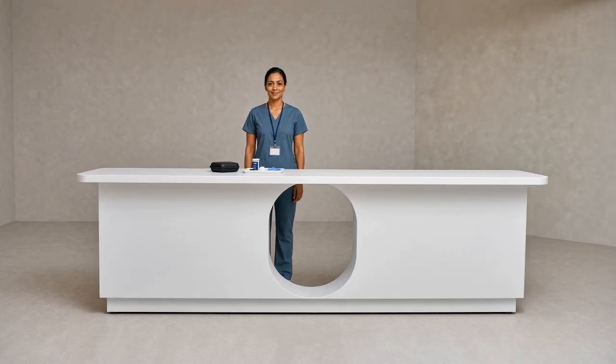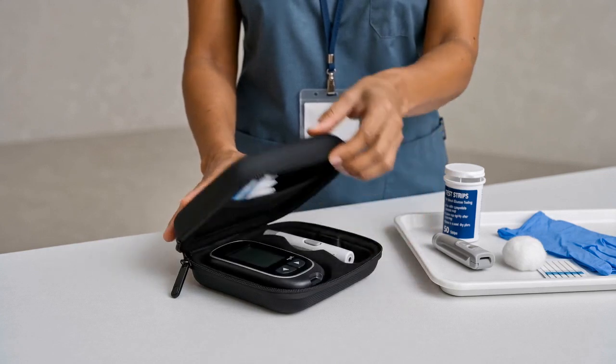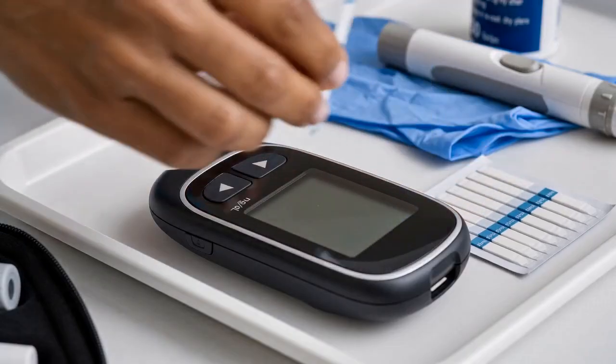Ask practical questions. Has the resident eaten? Is the meal ready? Did the resident eat less or more than usual? Did the resident refuse the meal? Has the resident been vomiting or unable to eat? A resident's food intake can affect blood glucose and may be especially important when insulin is involved.